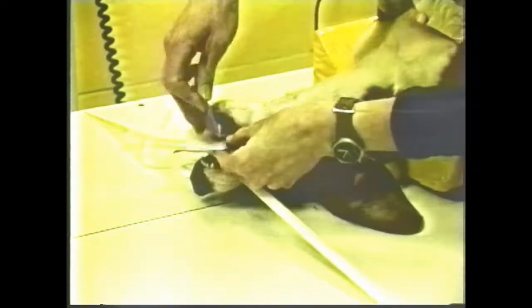This shows the use of dental film, which is packaged in relatively small units and can be used in an intraoral situation. This is non-screen film, therefore it does require much greater exposure than we have been used to with screens in cassettes. This adds to the possibility of greater technician exposure during this procedure. We must cone down so that the beam is controlled to the greatest extent.